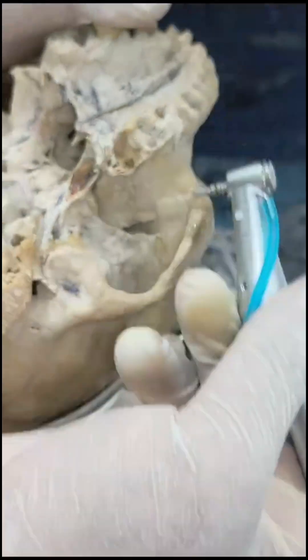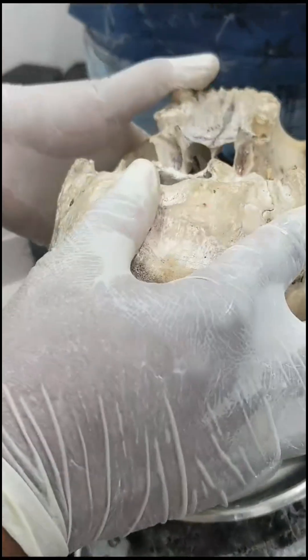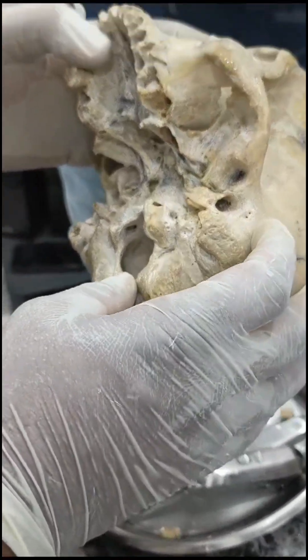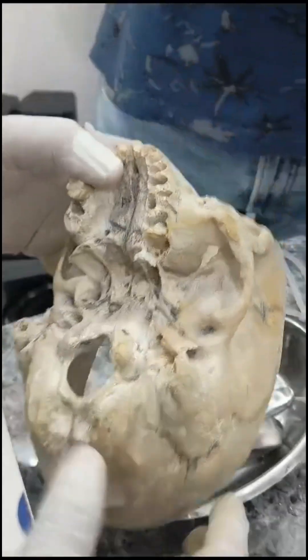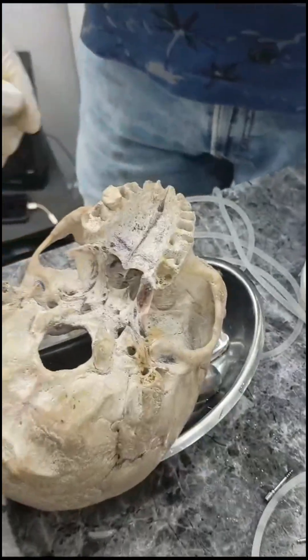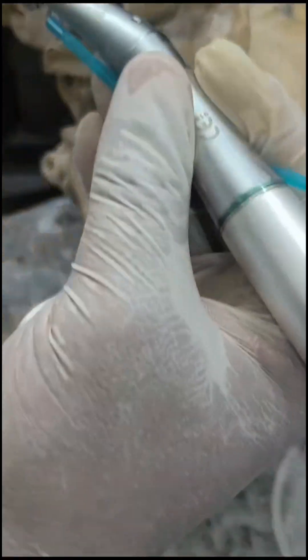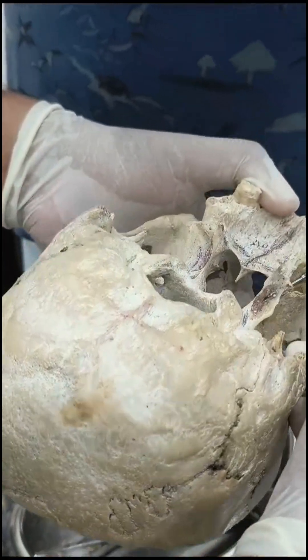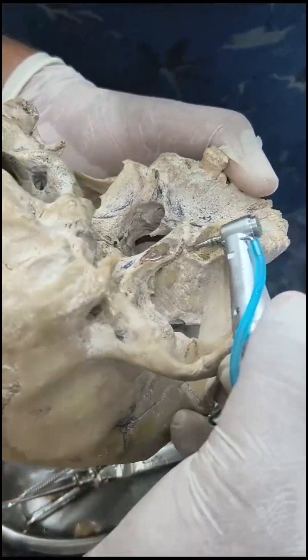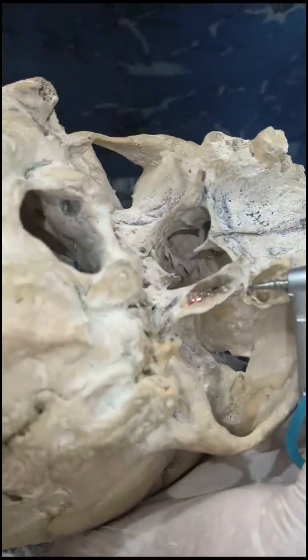Since the skull is a very dry kind of skull, we need not force it too much. One more thing to be noticed is how to select the implant size.